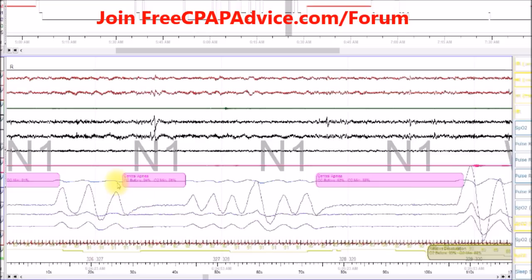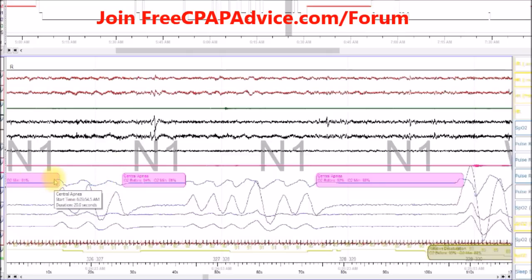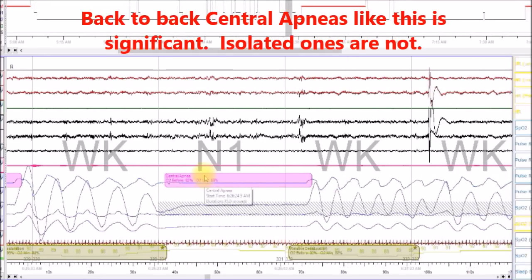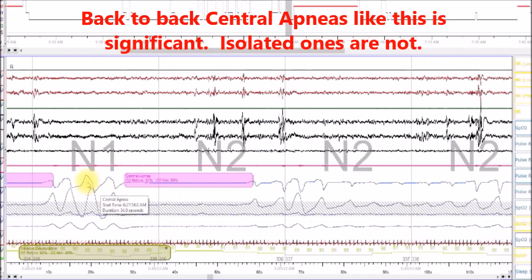So you can see there's just a string of these central apneas. And if I increase the airflow, you can see that there's no spike before it. Usually you see steady sleep going on, sometimes you'll see a spike, then a central apnea, or then more sleep — that's kind of an isolated incident. Well, you don't see that here, and that's a tip-off that this is true. These are real central apneas — the person simply stops breathing. And we have a longer central apnea here.